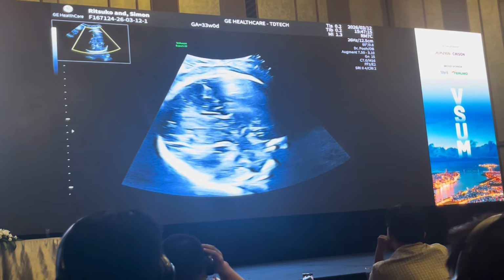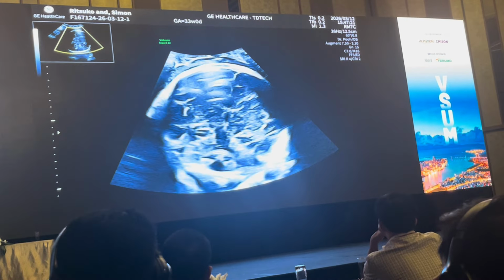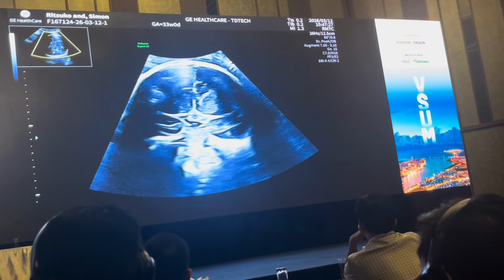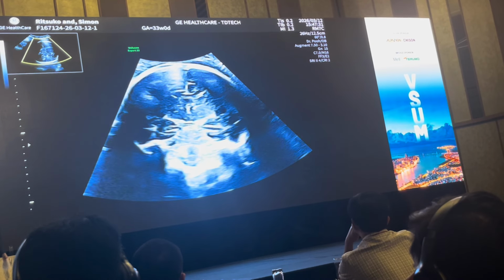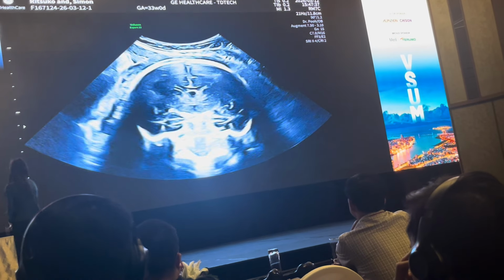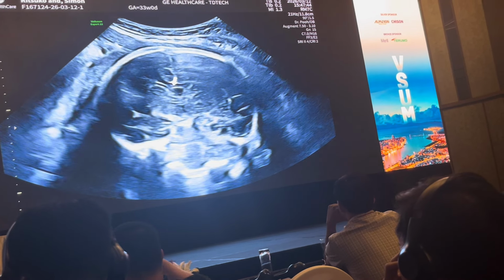So you come around, the next thing to do is to use your other hand. Now can somebody come in here and push for me? I need an extra pair of hands. Thank you, just there. So you get an extra pair of hands, and then once you're in that position, I mentioned to you about the sandwich. So what you do is you then next reduce your depth. The first thing I do is reduce my depth, and then I toggle my zoom.